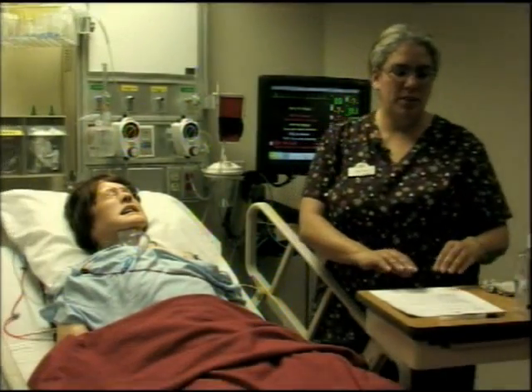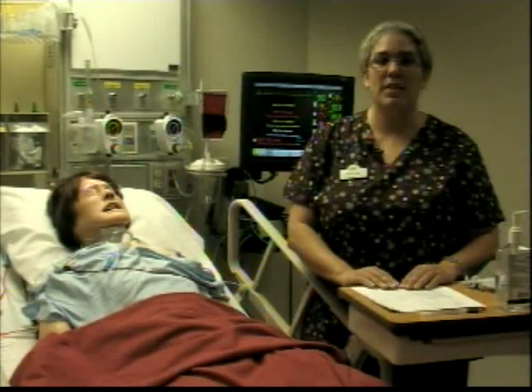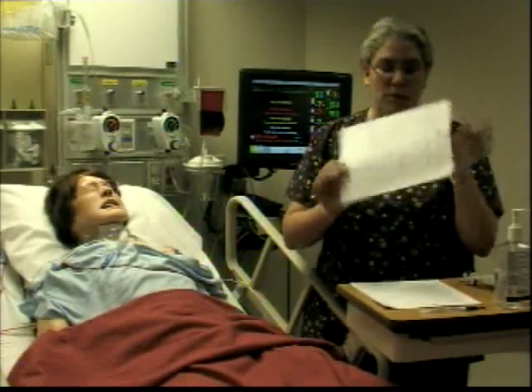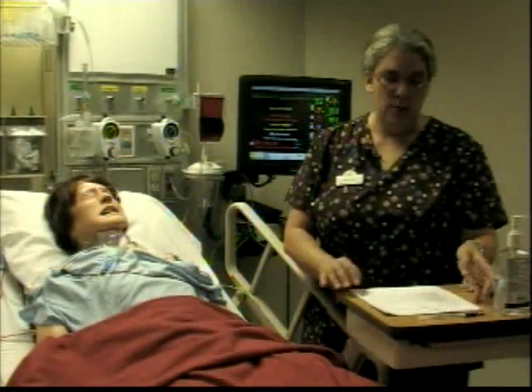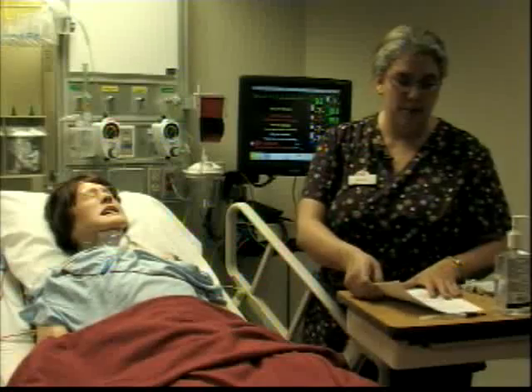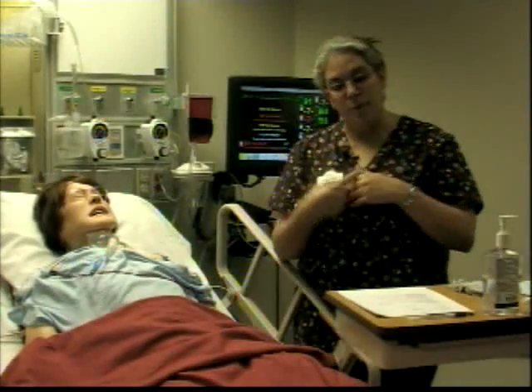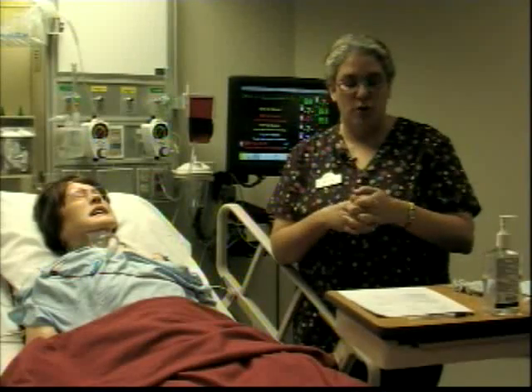Today we are going to discuss how to perform a central line dressing change on a client, and your checklist is going to be in WebCT like the others are, and we are going to take it through a perspective of the nursing process. So we're going to talk a little bit about what you need to do prior to going to your patient's room, and then I'm going to give you the demonstration.